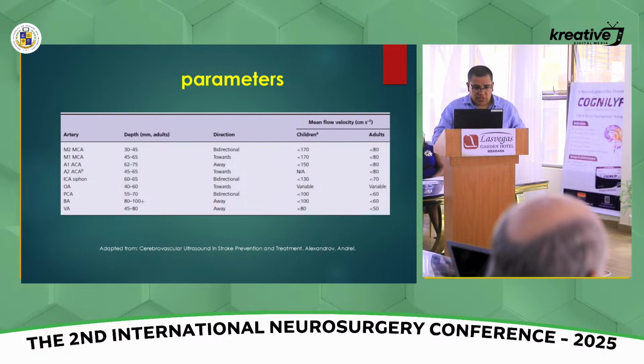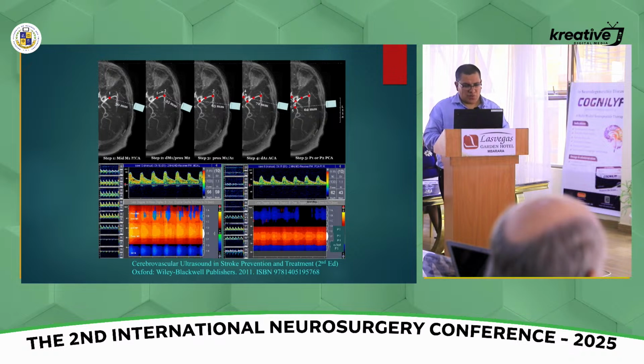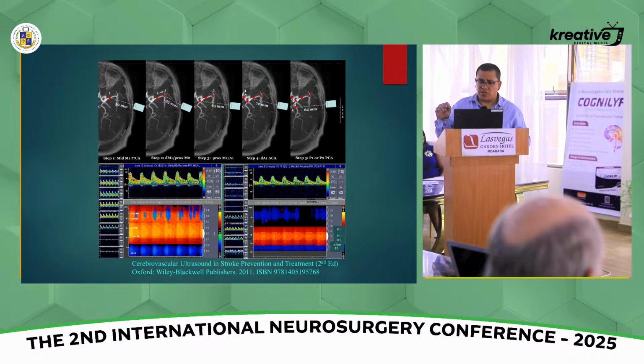This is another example just for you guys to see what the spectrum looks like. Some of the machines come with this spectrum of Doppler in which you can actually aim your probe in a particular direction, and you can change depths rapidly, and it's going to give you different images, and it's going to allow you to identify the vessels in a better fashion.